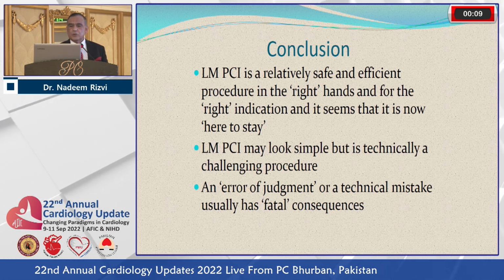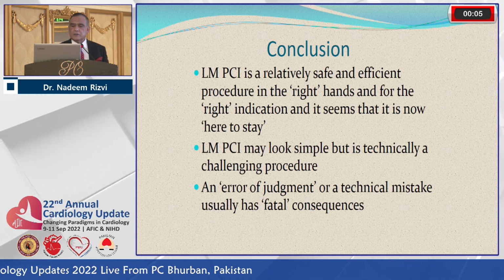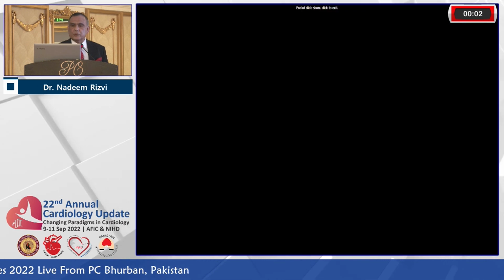Left main PCI may look simple, but it is technically a challenging procedure. Any error of judgment or a technical mistake usually has fatal consequences.